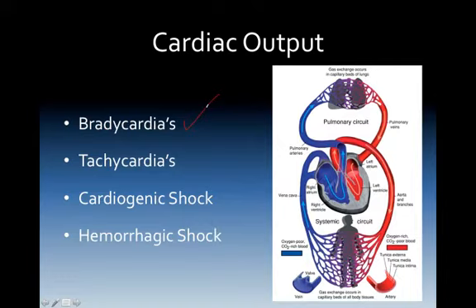In cardiogenic shock, trending end-tidal CO2 with lower CO2 levels may indicate a perfusion problem and be one of the earliest signs of us understanding that the person is going into a pump-related shock. Hemorrhagic shock, assessing effectiveness of fluid resuscitation. Simple principle: when enough fluid is on board, perfusion and CO2 will return and increase through the sampling.